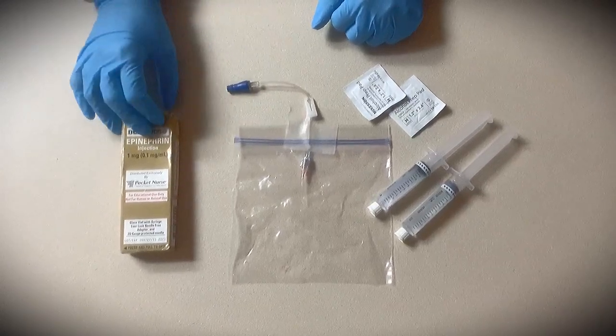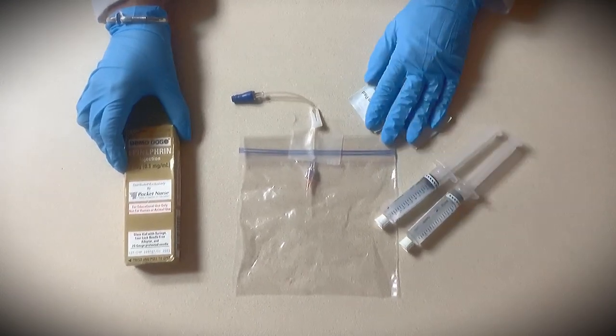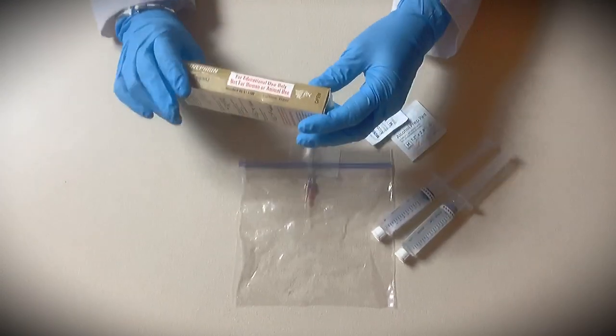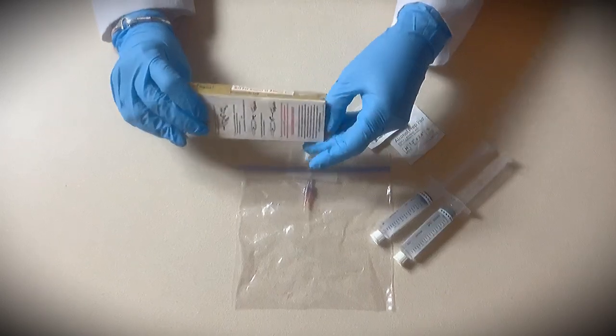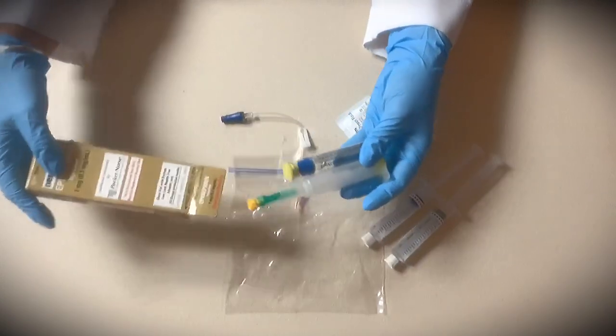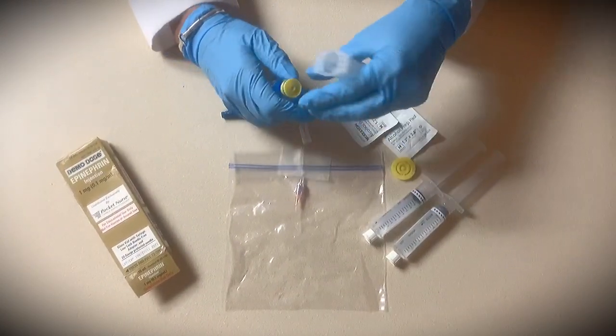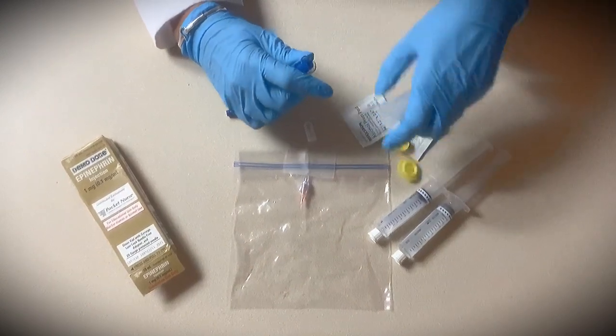For the epinephrine, first thing you're going to want to do is prepare it to be administered. You have your two flushes and your alcohol pad. To prepare it, you're going to open it at the end where it says open, drop the two parts into your hand, and remove the caps from each end.